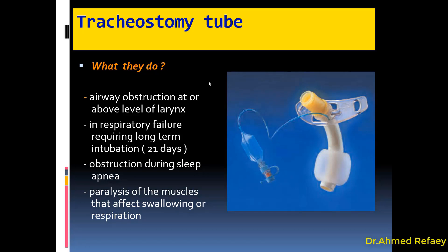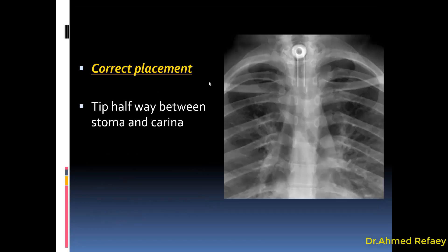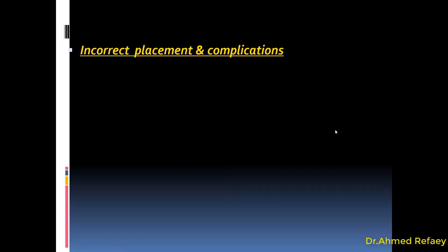Regarding the correct placement of the tracheostomy tube: the tip should be halfway between the stoma and the carina. As you see here, this is the stoma, this is the carina, and this is the tip of the tracheostomy tube — this represents the normal or correct placement.